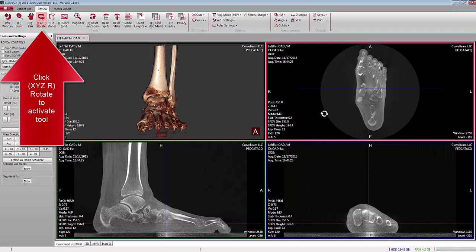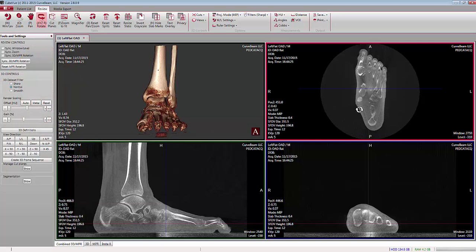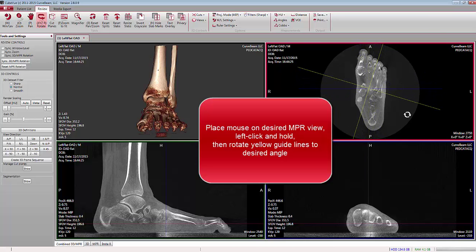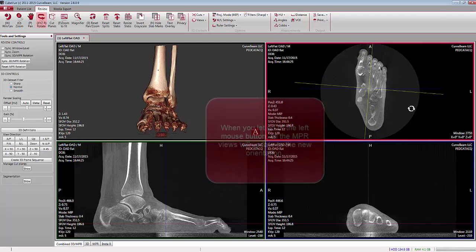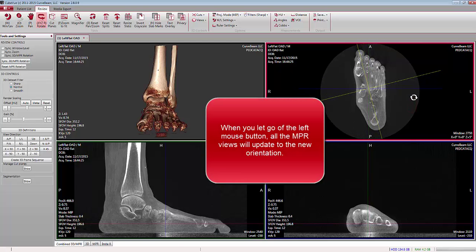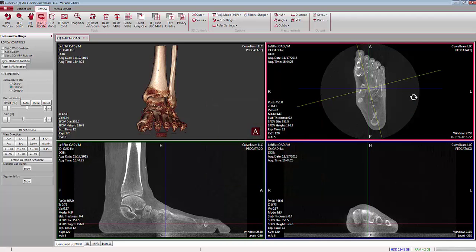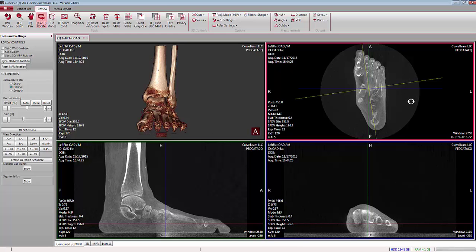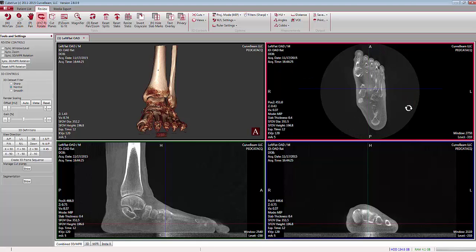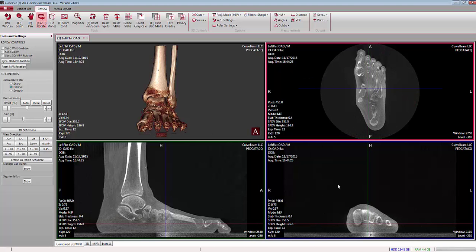When you click on it, notice your mouse has changed shape — we now have the ability to rotate. Left-click and hold the mouse down and yellow guidelines appear. Notice how they are centered where the cursor lines cross. When you let go, look carefully at all the views — they now update and change their orientation. Left-click and drag, use the yellow lines to line up with the relative parts of the anatomy, and again the view updates.